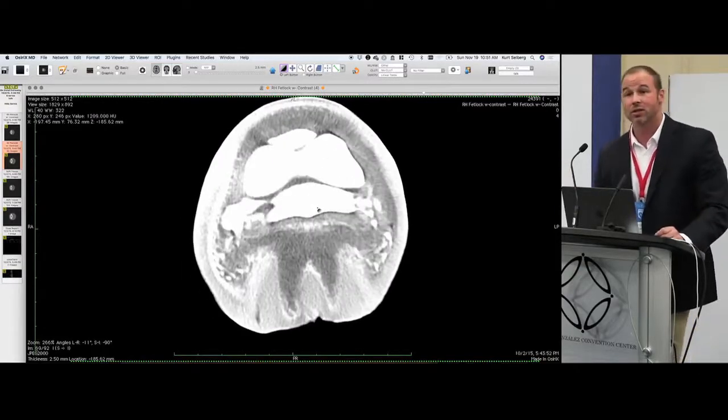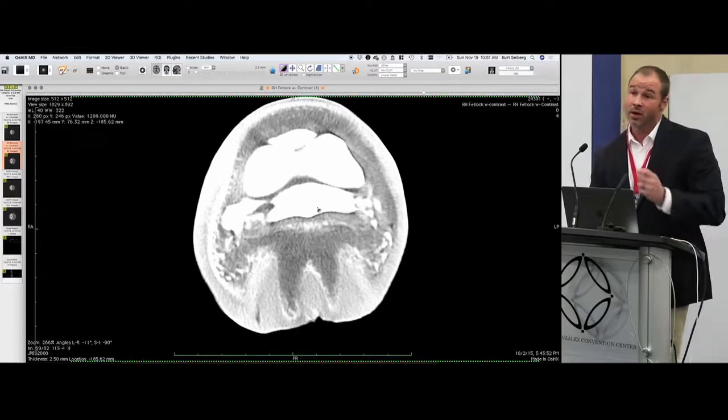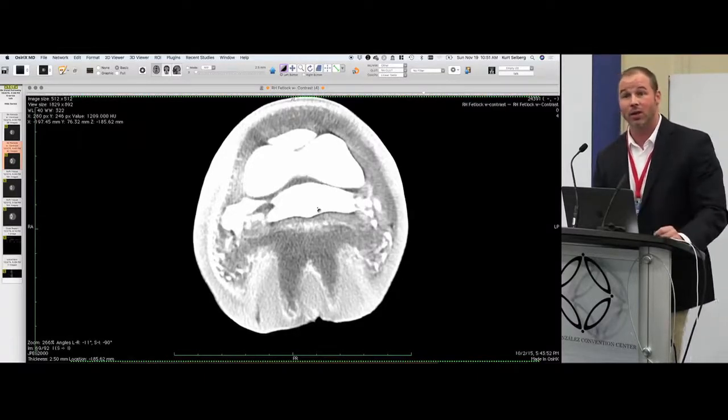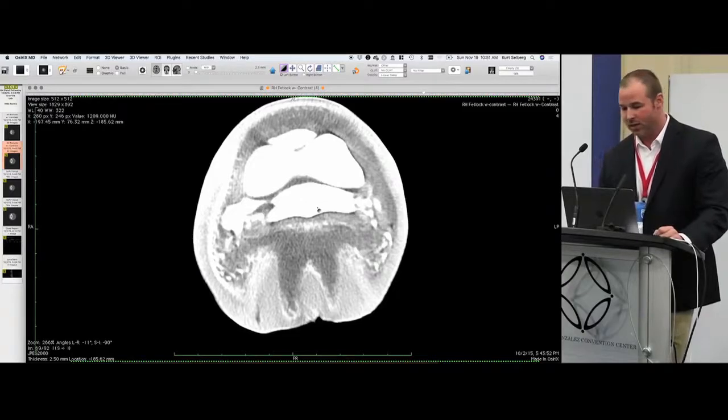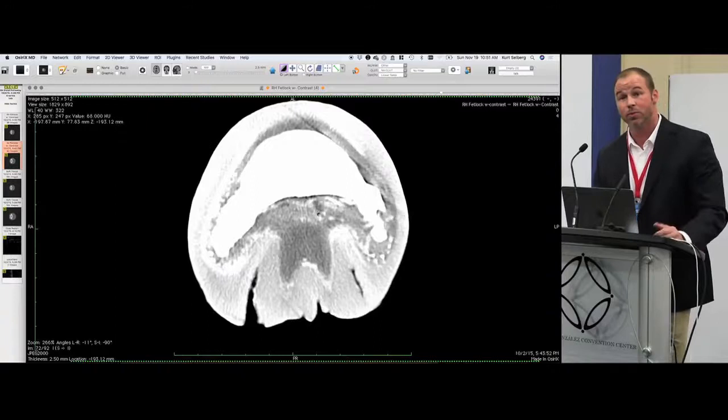If we see those kinds of lesions in the CT, we can then opt to treat those, especially with some of our stall-side treatment options that we have. We can do a quick PRP run and put our biologic into the deep digital flexor tendon using CT guidance, and those are pretty easy to do under general anesthesia for sure.